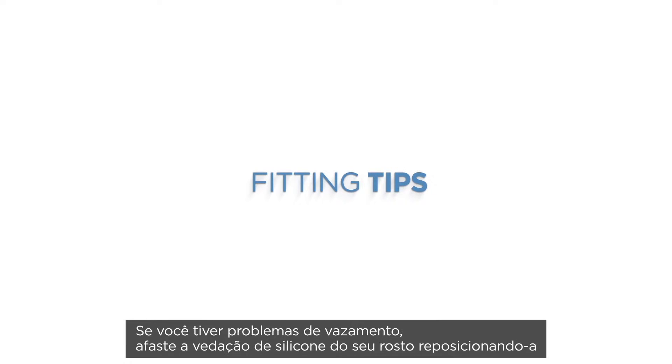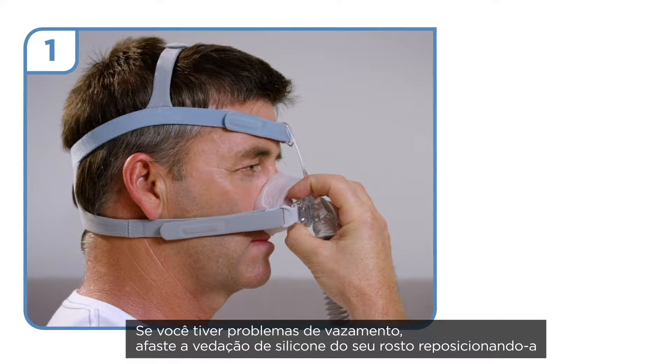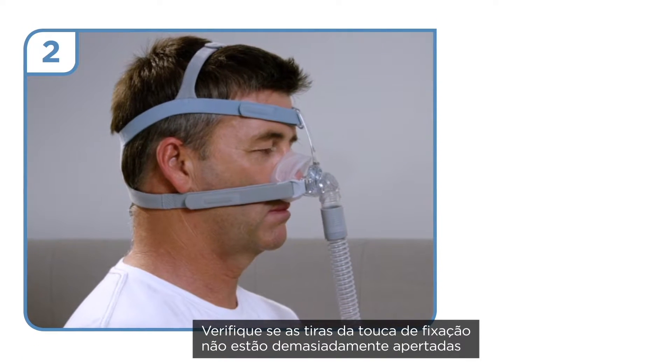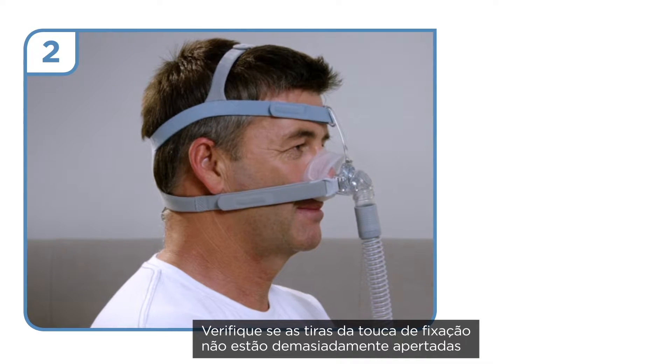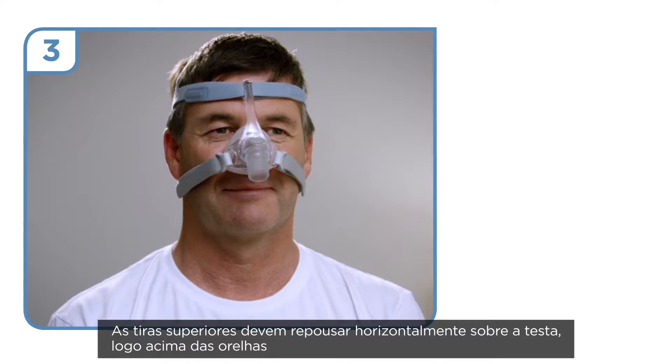Fitting tips: If you experience seal leaks, lift the silicone seal off your face and reposition it again. Ensure the headgear straps are not fastened too tightly. The forehead strap should rest horizontally on the forehead, just above the ears.